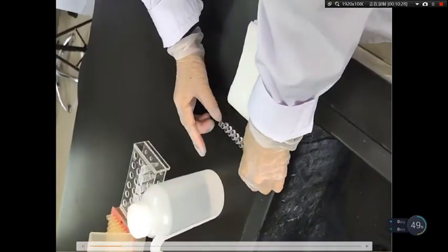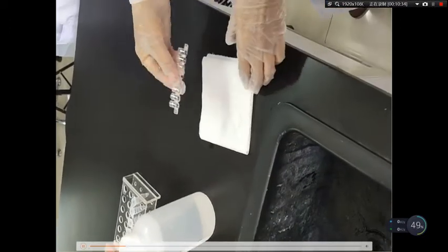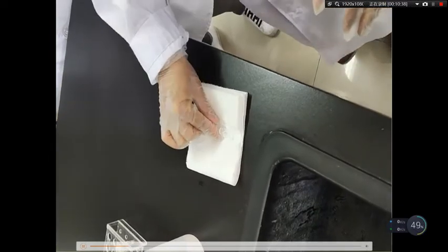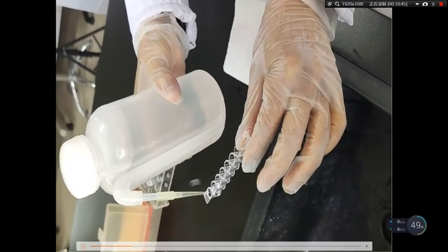Stay for 1 minute. After 1 minute, we decant the solution and blot on a clean dry paper towel. And we repeat the washing.